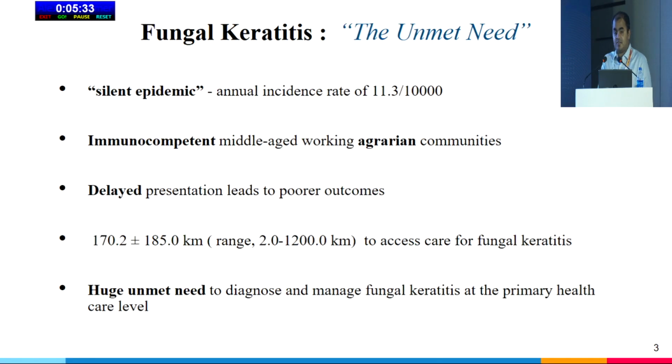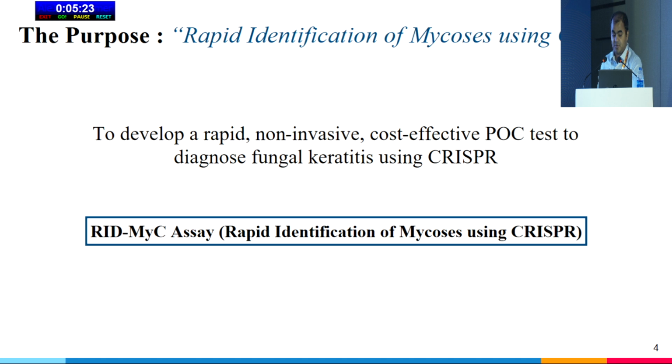For any new diagnostic modality, it's important to understand the unmet need for that particular condition. For fungal keratitis, there's a huge unmet need to diagnose it at the primary healthcare level. So our purpose was to develop a rapid, non-invasive, cost-effective point-of-care test to diagnose fungal keratitis using CRISPR, which we have termed RID-MYC, which stands for Rapid Identification of Mycosis using CRISPR.